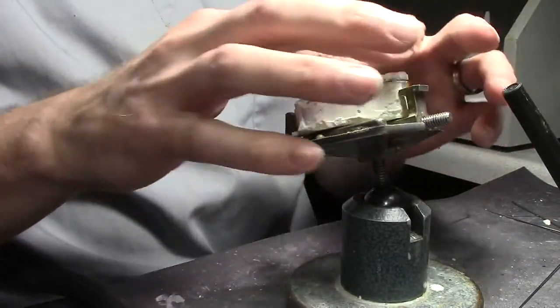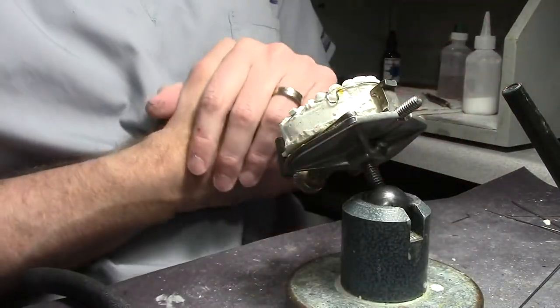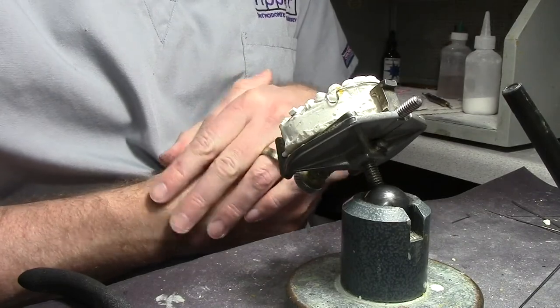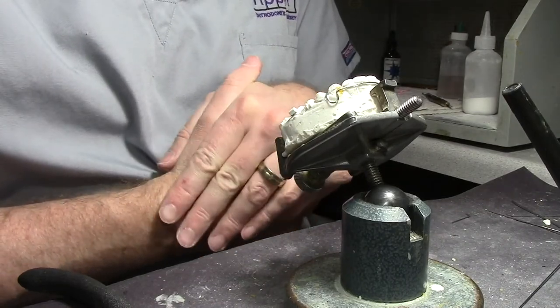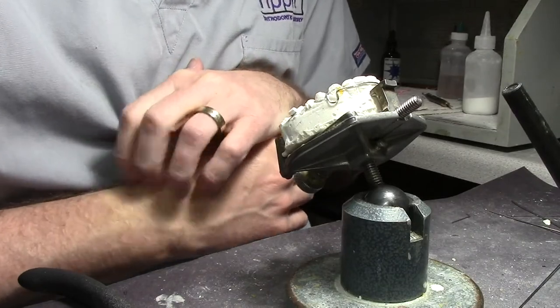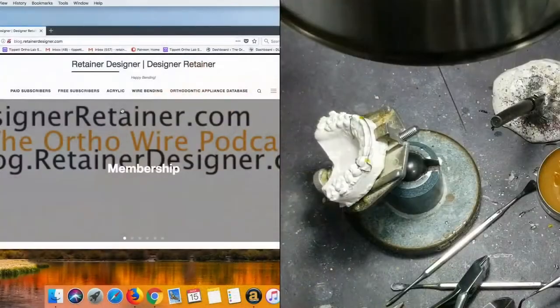So I've got the labial bow down. Lateral arms — I'm not sure I know what you're talking about regarding lateral arms. I have not done a video, Greg, on lab marketing, especially ortho marketing.